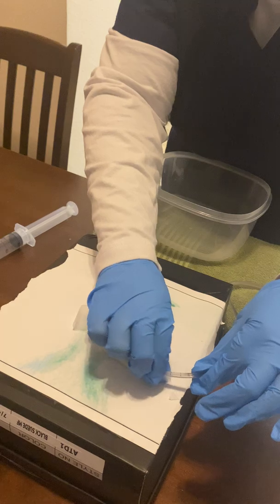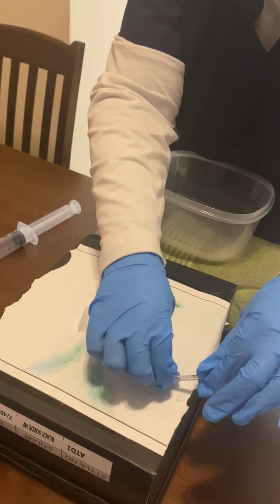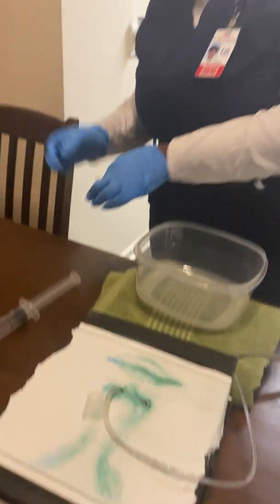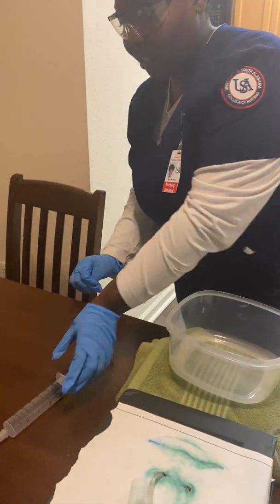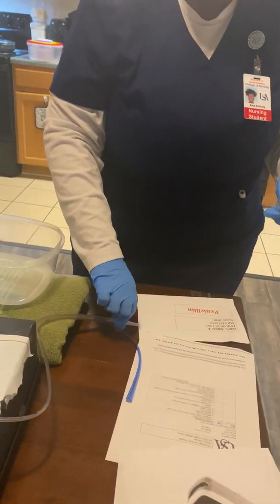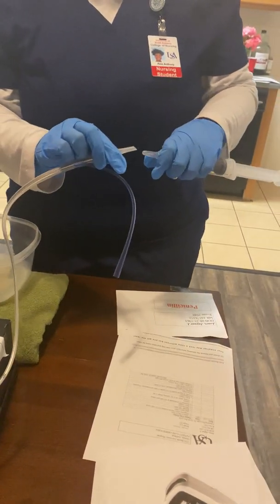Okay. And then once I have done that, I will have also connected my 60 milliliter syringe to the end of my tubing.